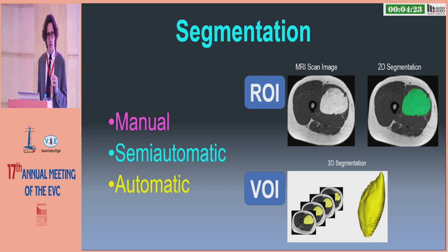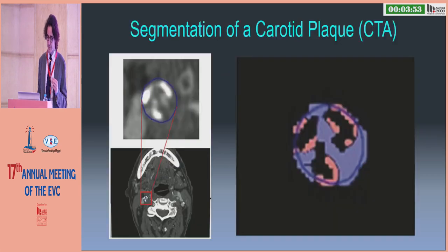However, there are softwares that have been developed to do semi-automatic or automatic segmentation of the images. This is a critical point of radiomics, as of course, what we are going to interrogate with radiomics is the area that we have chosen. So, of course, if the area is precise, we will have precise information about the question that we are asking to our imaging modality. If the segmentation is not precise, of course, this will create a bias when we are going to interpret our results.